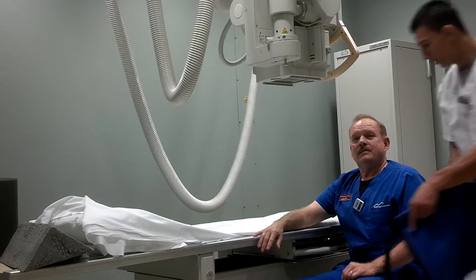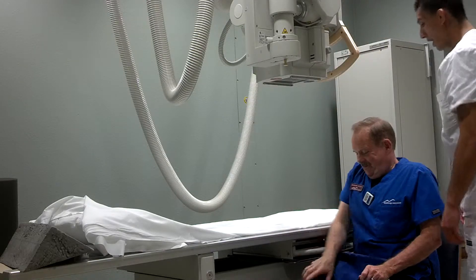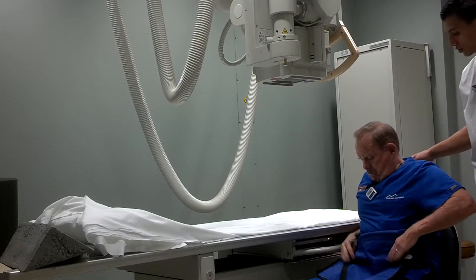So we have our shield here. We're going to lay this on your left here just like that. And it's the right shoulder, correct?